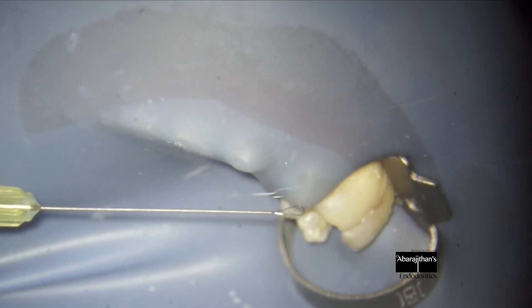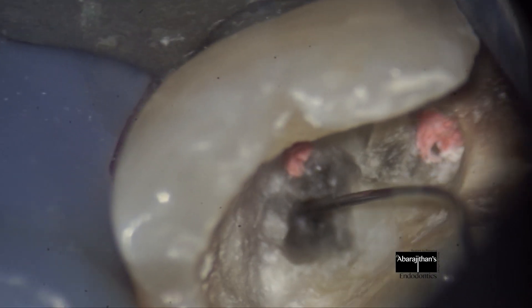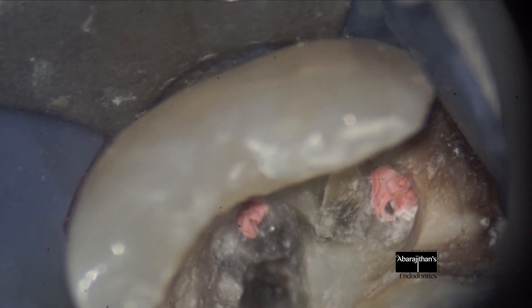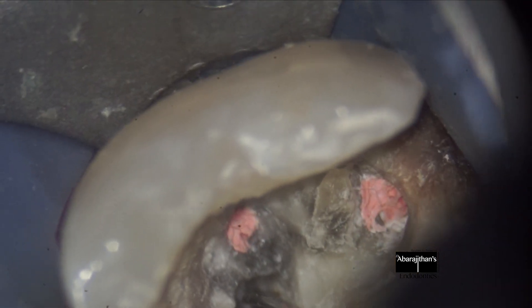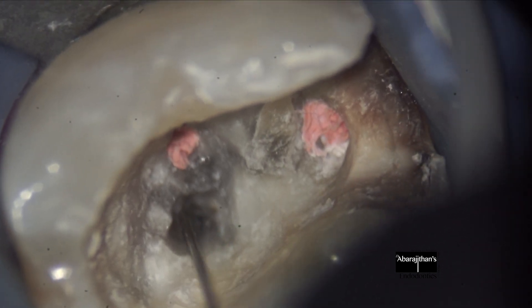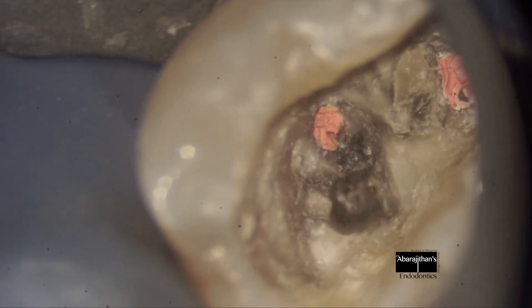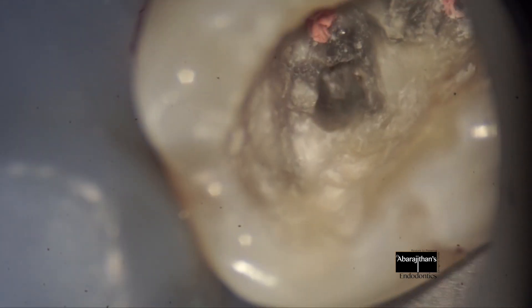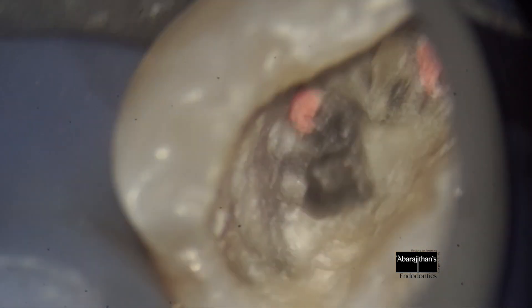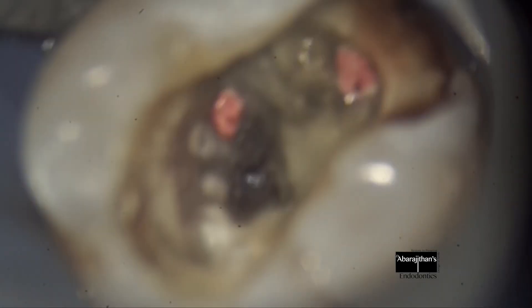Though we have tried a lot of do-it-yourself loops, one of the most predictable micro loops is the BTR pin. Here I engage it after the instrument gets loosened and just pull it out. Here we go — you can see that we have removed the instrument without damaging much of radicular dentin.